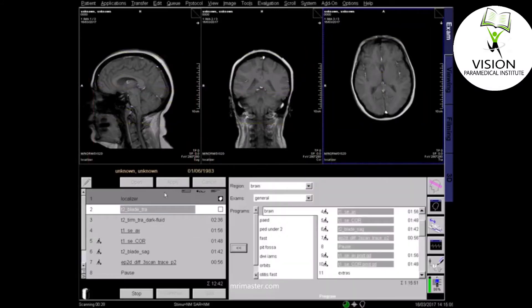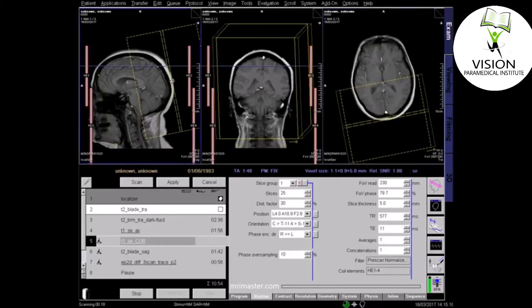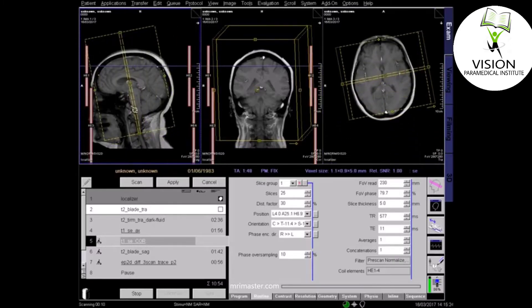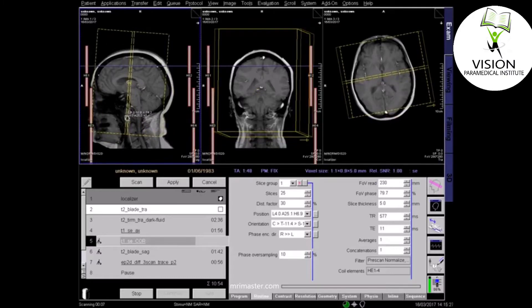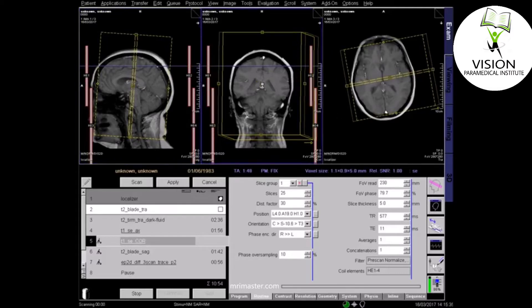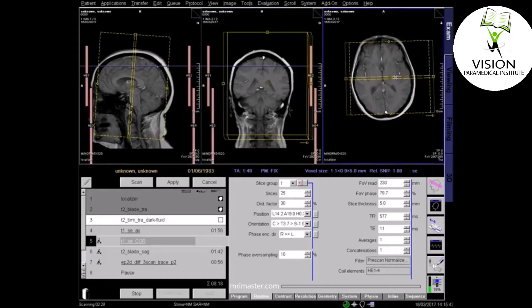Now plan your coronal sequence using all three localiser planes. On the sagittal localiser, the coronal slices should run perpendicular to the line from the genu to the splenium of the corpus callosum. Ensure that the slices cover the entire brain from frontal sinus to the posterior occipital lobe. Center the image in the coronal field of view. On the axial view, the slices should run perpendicular to the midline of the brain, with the centre point lying over the midline.